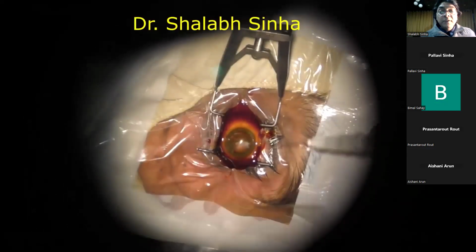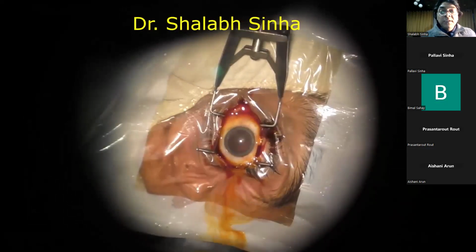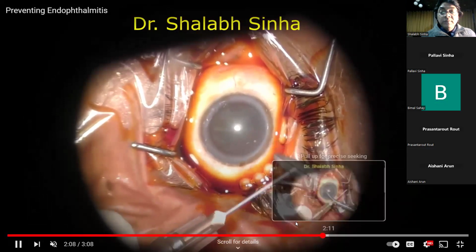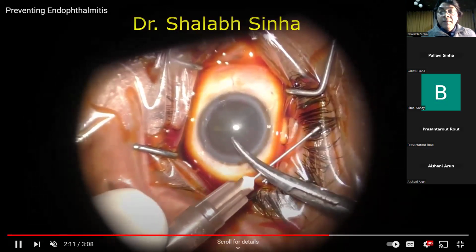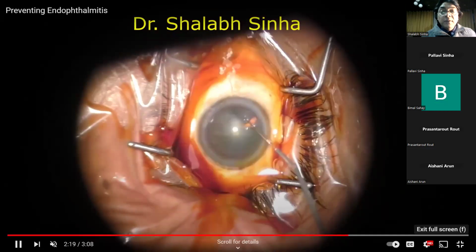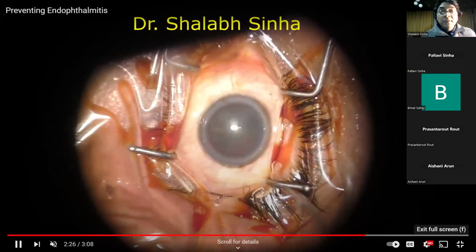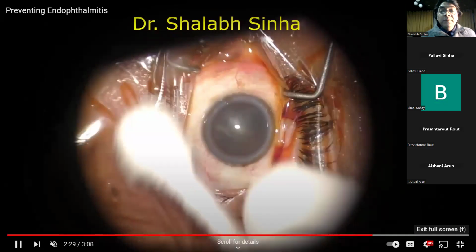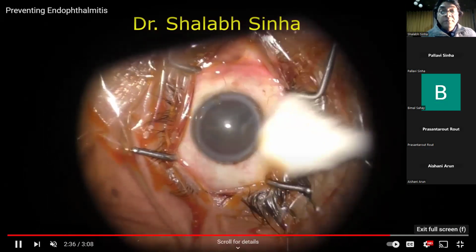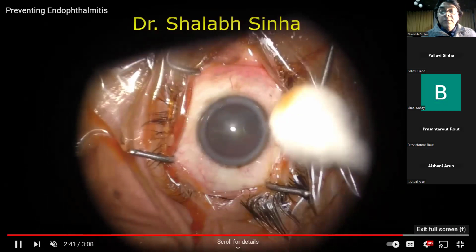A few drops of povidone iodine again instilled in the eye and washed immediately. And then you make your cystotome and bend it. Make sure to wash the sac very well because betadine is toxic to the endothelium, and you must squeeze out all the betadine that is there, but so that it doesn't go inside the eye. Just press it a little bit. Okay.